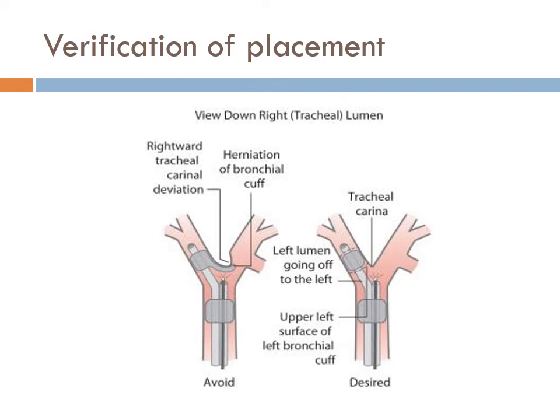This is a very dramatic picture of a herniation. It never herniates like that. Herniations happen all the time for normal breathing tubes, and with these it's much more sensitive to be displaced. I actually had a pediatric herniation two days ago in the OR. Luckily, there was no emergency, but it would have been if we lost our airway and the patient desatted. But again, I wasn't getting my tidal volumes, and I heard a little bit of a leak, and you don't really know what's going on.